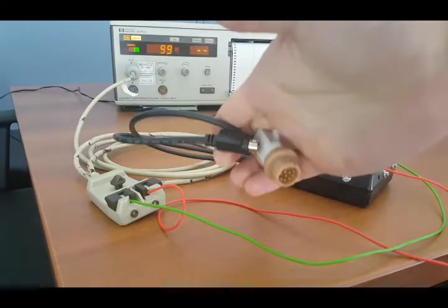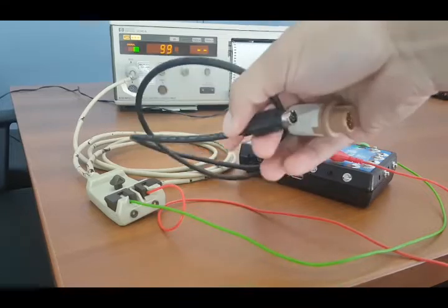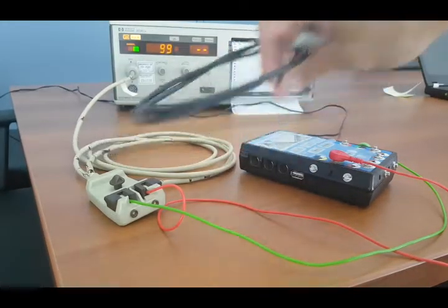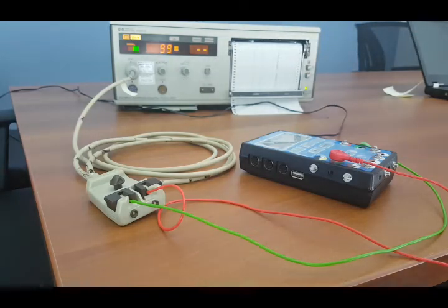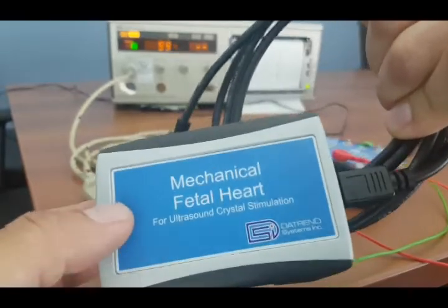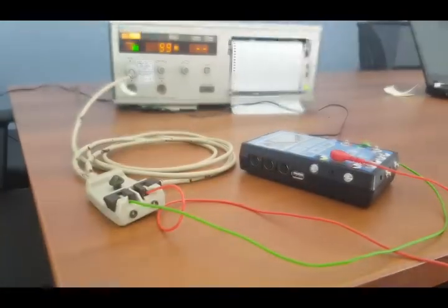I have a customized cable here for the TOCO input. Same thing here, I have a cable that can be connected to the FMS-3. And I also have a mechanical fetal heart simulator, and I'll demonstrate this in a moment as well.